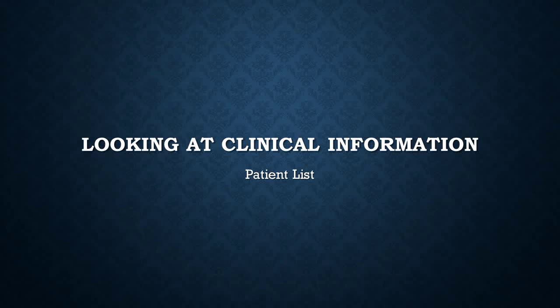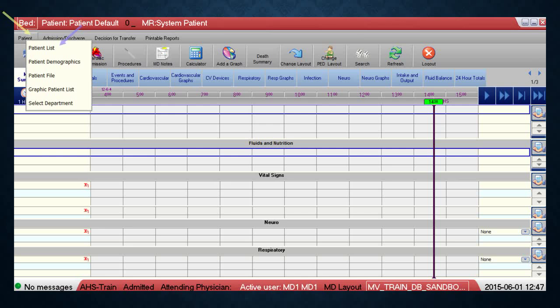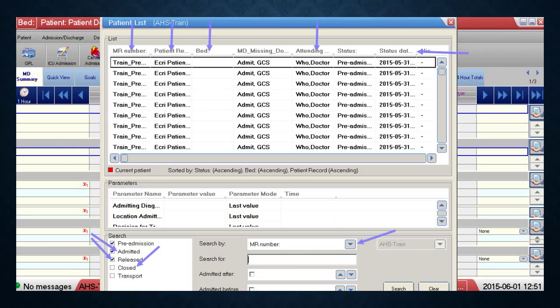Another way to look up patients — including those not on the GPL or recently discharged — is to use the Patient List, found by clicking the Patient drop-down menu in the upper left and selecting Patient List. This opens a dialog box where you can scroll through patients organized by hospital number, name, bed, and admitting physician. Clicking the column title acts as a sort function to sort alphabetically, or you can use the search option to search by hospital number, last name, or first name.